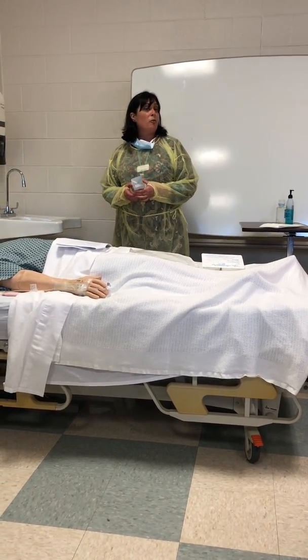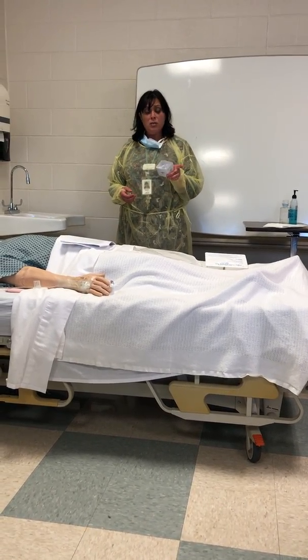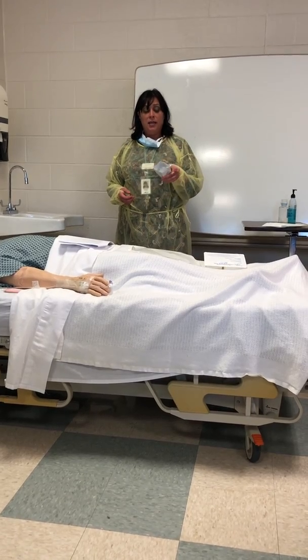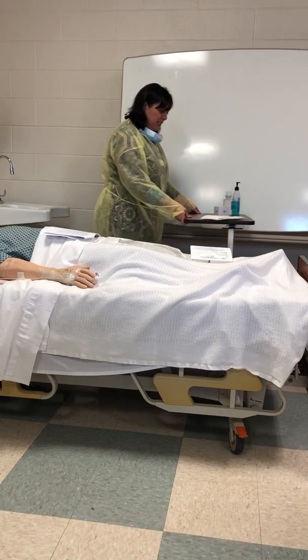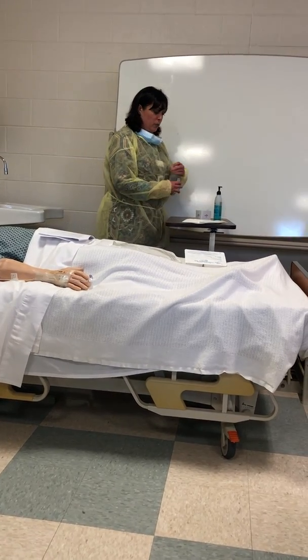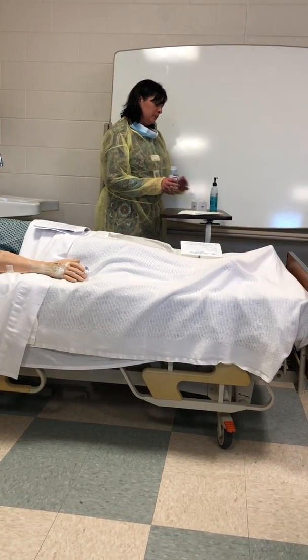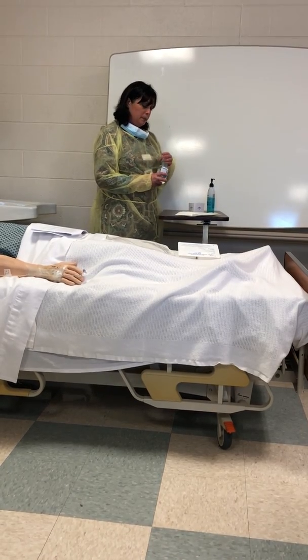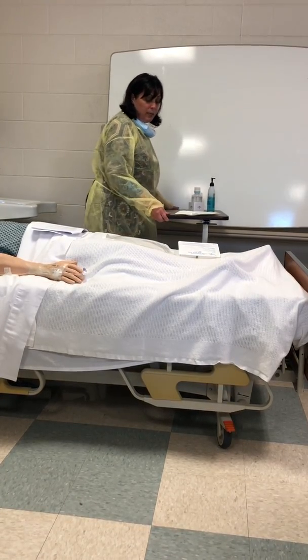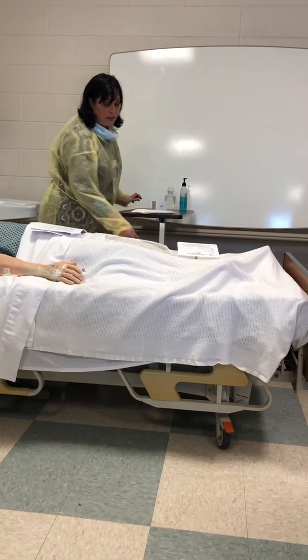Okay, so this box, I washed my hands before I came in. I'm not gonna touch the inside. The inside is what I'm gonna fill up with sterile water, saline, whatever your facility calls for. And that was fresh, brand new, just opened it.